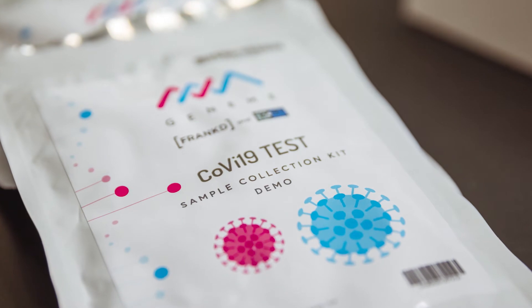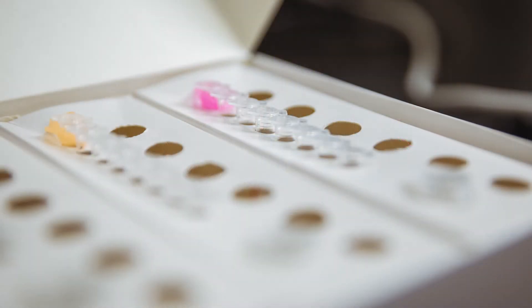FRANKD is an isothermal reaction test that allows the detection of nucleic acids. We can detect the SARS-CoV-2 RNA directly from the sample. The reaction happens within 30 minutes from the start of it. It also allows us to obtain the results without the RNA purification step, which is very crucial when you process a large quantity of samples.